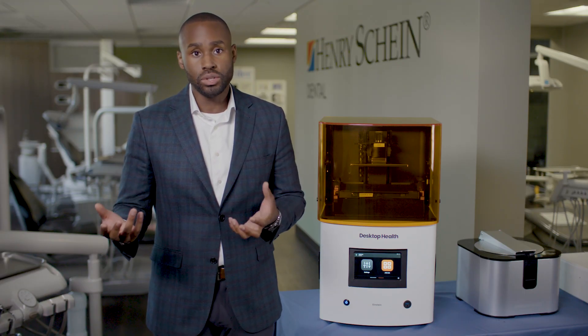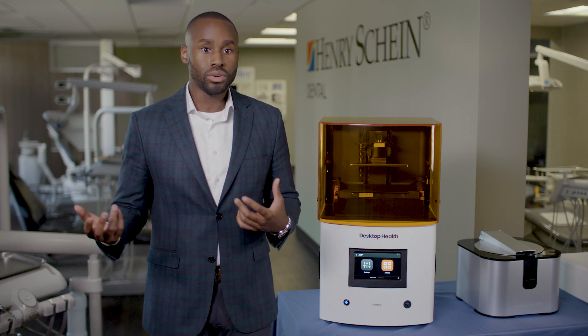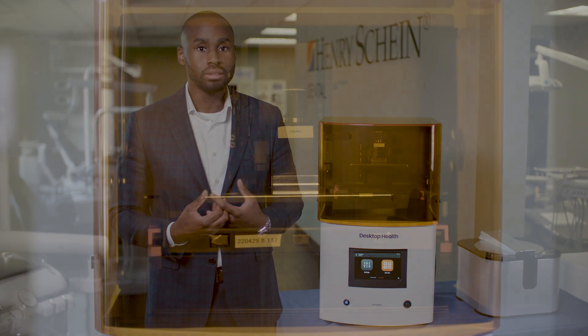If you're unfamiliar with designing a surgical guide, be sure to reach out to your local Henry Schein equipment specialist who can walk you through your options for designing solutions. Once the final appliance is designed, either by you or your lab, you're ready to import the STL into your 3D printer software and start printing.